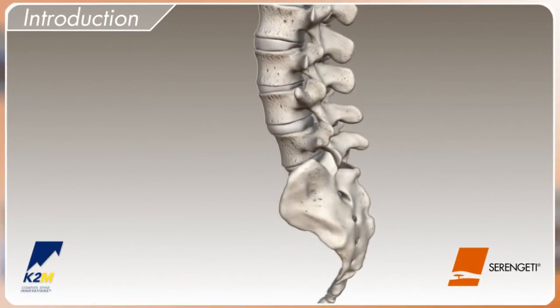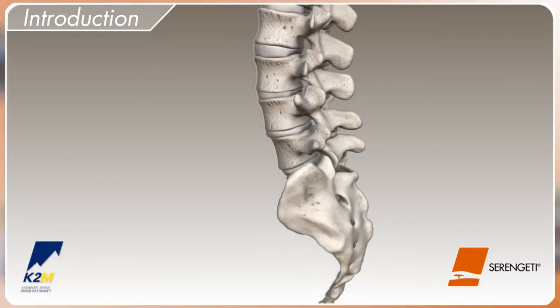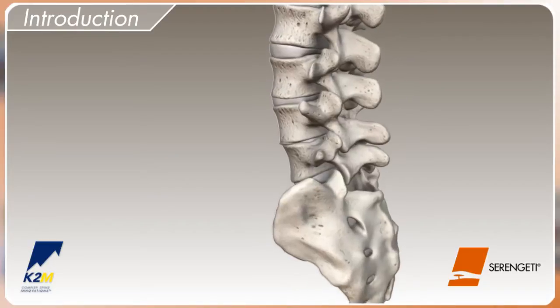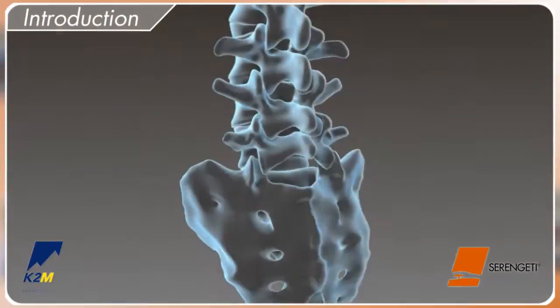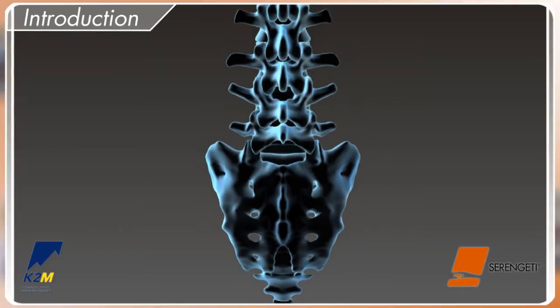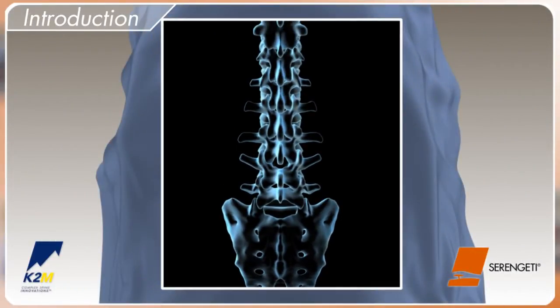For many, back pain exists as a fact of life. When posterior fusion becomes necessary, minimally invasive surgery is often turned to as a standard of care. The Serengeti Minimally Invasive Retractor System from K2M offers all the benefits of a minimally invasive approach, along with the ease and visualization of an open procedure.